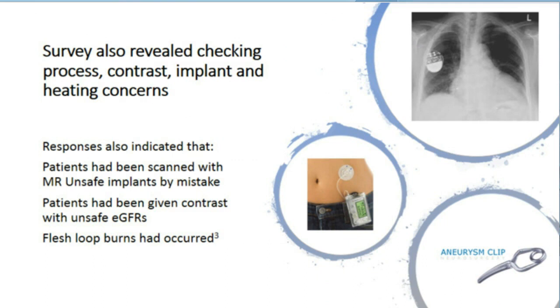The fact that almost 70% of respondents took the time to make additional comments on what they thought was wrong with safety suggested that staff were heavily invested in the subject, and the comments revealed a great depth of feeling. Comments implied that there was a general lack of knowledge of the risks and hazards, and there was an overwhelming belief that introducing standardised MRI safety education would positively influence MRI safety practice, with 90% support for this. The lack of adequate referral information from referrers also indicated that this group of staff needed an educational resource too.